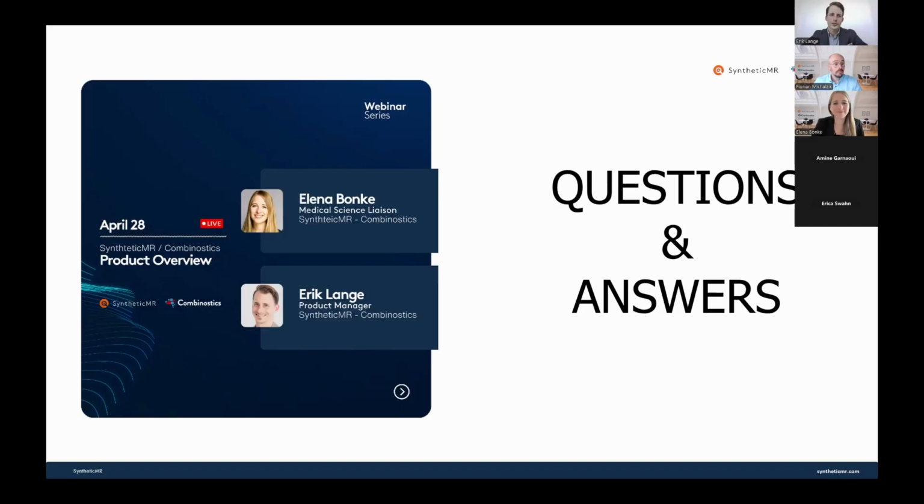I could just mention also that it's also possible to have multiple outputs sent to multiple locations. We have some customers that are both in clinical and in research, and sometimes they have a research PACS set up, so a clinical PACS and a research PACS. We can send one set of outputs for the clinical routine imaging and another set of outputs to a research PACS if you're conducting a research study and don't want that in your clinical PACS.